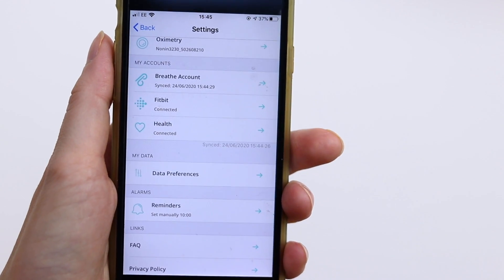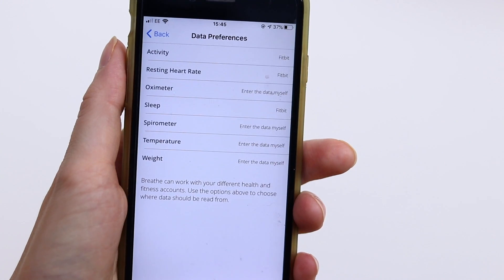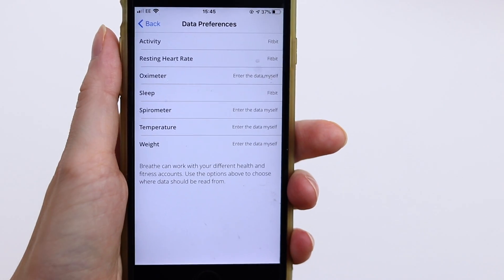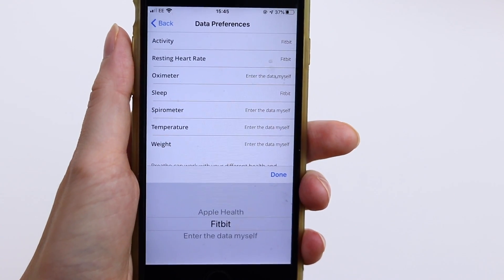If you're still not seeing the data you'd expect after connecting, check that your data preferences are set correctly. Breathe can work with a number of different health accounts at the same time, pulling different records from each. Go back to the Breathe settings and tap on the Data Preferences link — you'll see a list of measures and the account each should come from. Make sure the correct account is selected for each measure, and to change it just tap on the source and select the account you want. Head back to the home screen, pull down to sync, and hopefully everything should appear just fine.